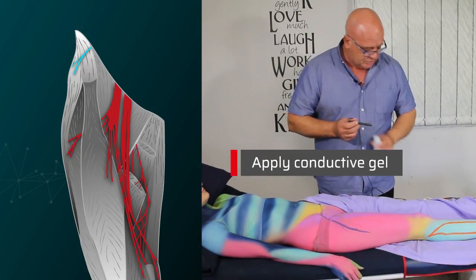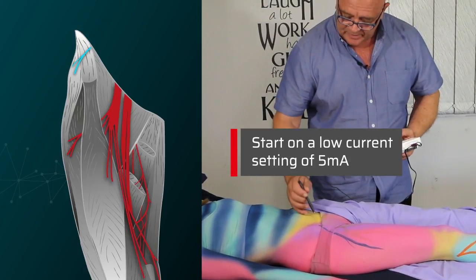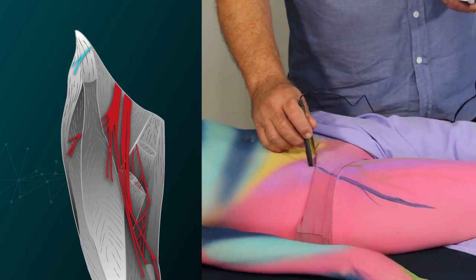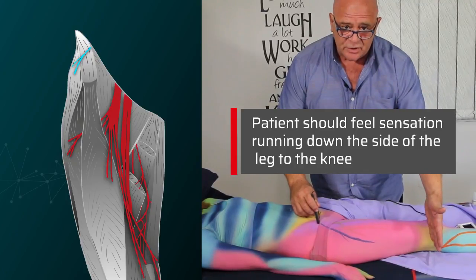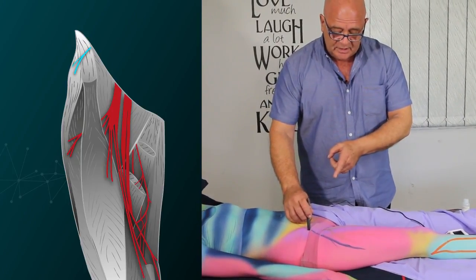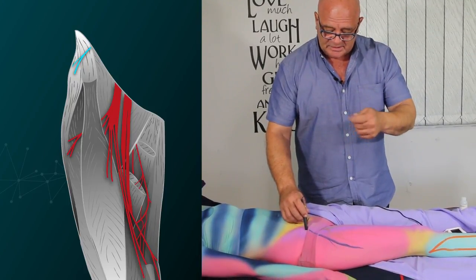We'll put a little bit of conduction jelly on the tip of our probe and start on a low milliamps of five. We're going to find the nerve around about in there. What are you feeling? — I'm feeling it going all the way down to my knee. So not below the knee. She says she's feeling it down the side of her leg, down to her knee, but not below the knee. So that's the lateral cutaneous nerve of the thigh — very easy nerve to find, very easy to treat. It's a nerve that very often requires treatment because it gets impinged or snared in a suture.